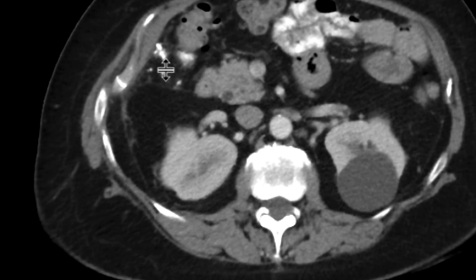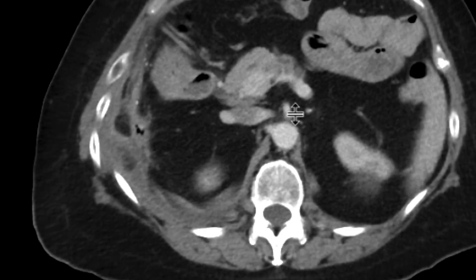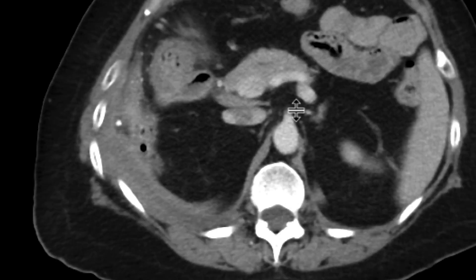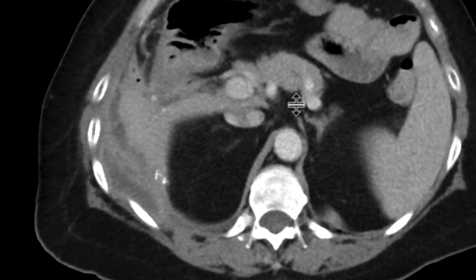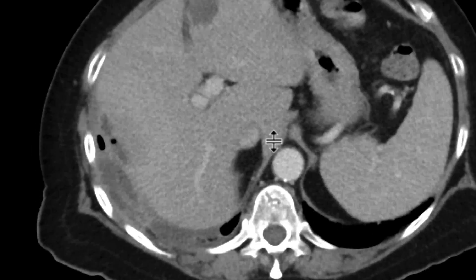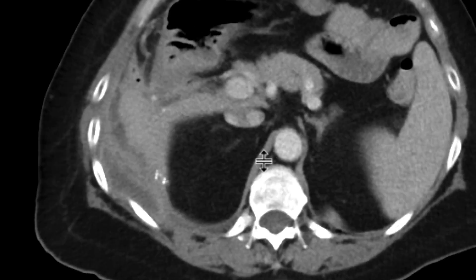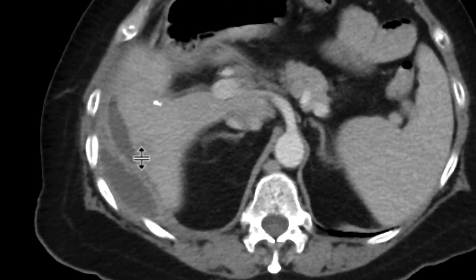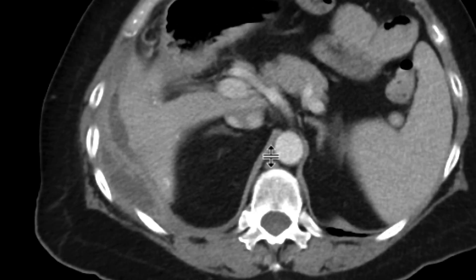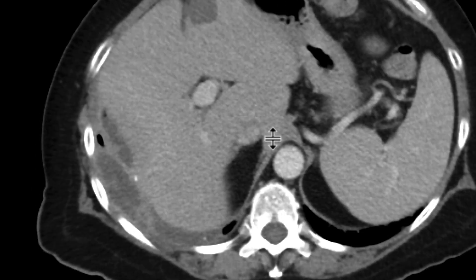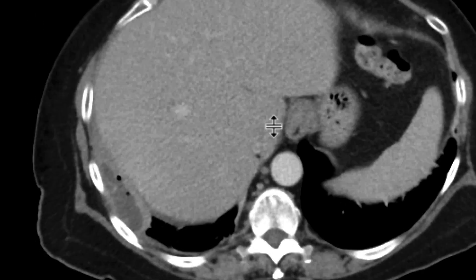You see a lot more calcifications even anterior to that. When you see these calcifications in the right side of the abdomen associated with these abscesses, you have to think about abscesses associated with dropped gallstones. This patient's gallbladder is missing — it was taken out. You can see cholecystectomy clips. This is indeed what it turned out to be.